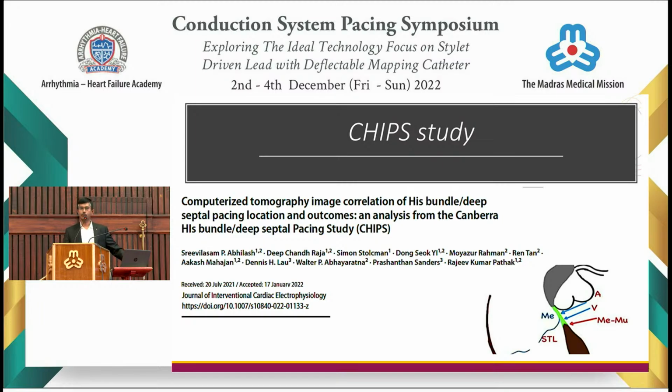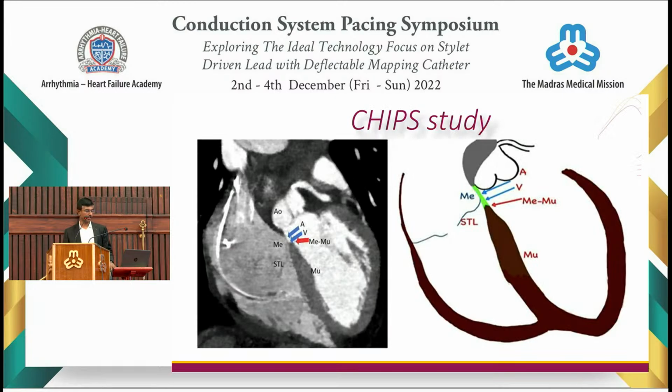Around the same time, we were working at the Australian National University with patients who had His bundle and left bundle branch pacing leads, and we had also derived some important insights into the failure of His bundle pacing leads and of left bundle branch pacing leads in these patients, if it fails. So what could be the parameters for failure? What we were looking at was a bit different from Dr. Vijay Raman's group.